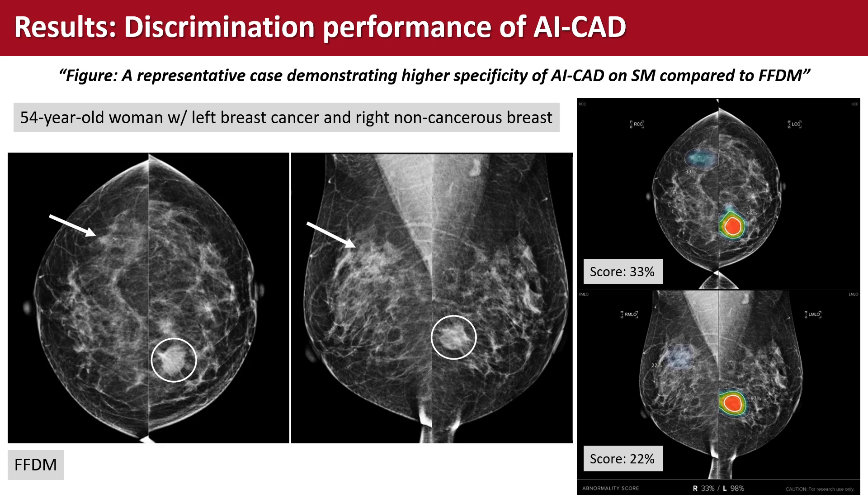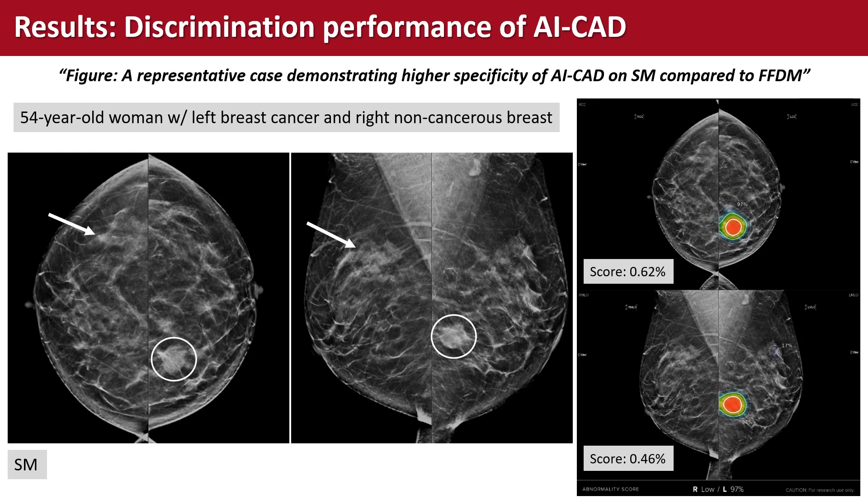Digital mammography shows a mass with microcalcifications in the left lower inner breast confirmed as cancer, and an incidental focal asymmetry in the right upper outer breast. AI CAD marks the asymmetry with scores of 33% and 22% on CC and MLO views. Synthetic mammography shows a less evident asymmetry with scores of 0.62% and 0.46%, and AI CAD does not mark the asymmetry because the scores fall below the 10% cutoff.